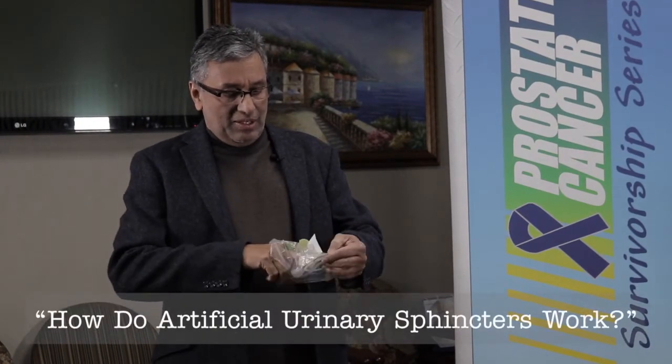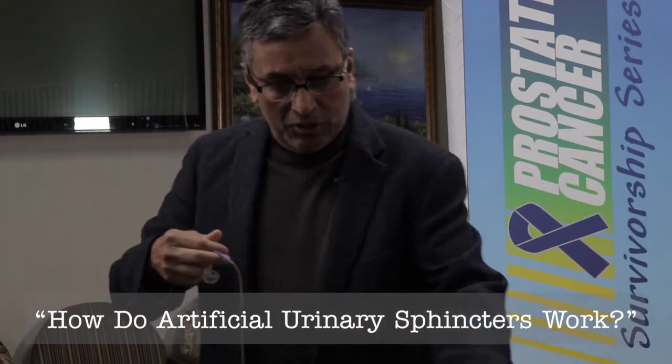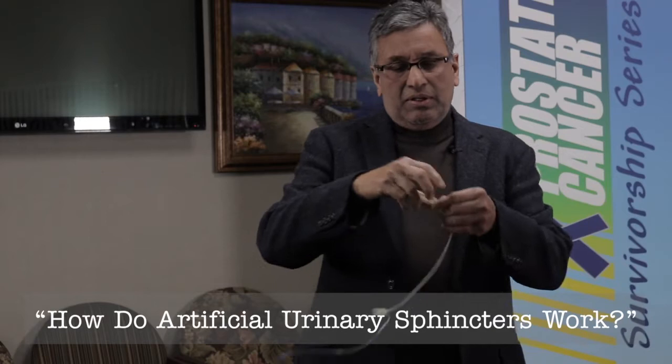This is the artificial urinary sphincter — lucky we found one here that is good. This is the cuff, and it goes around the urethra.